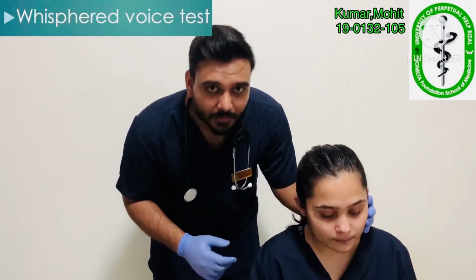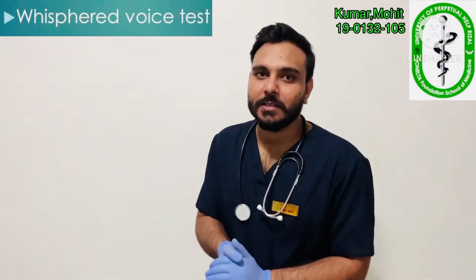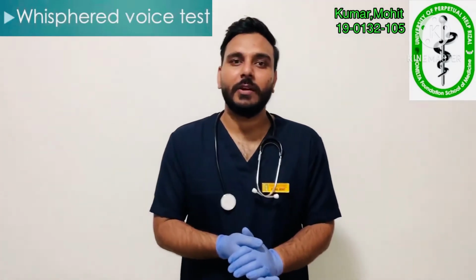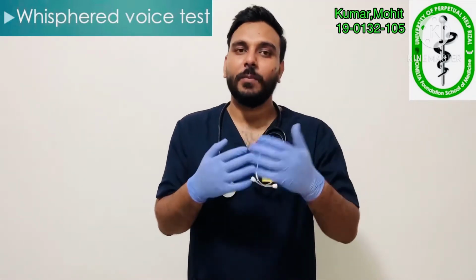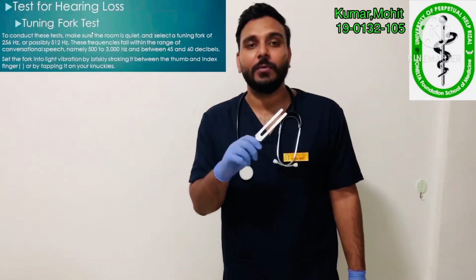We have to repeat this test for the second ear. So we are done with this whisper test, and our patient was able to recognize our words with proper coordination. The next test we are going to do with the help of the tuning fork.